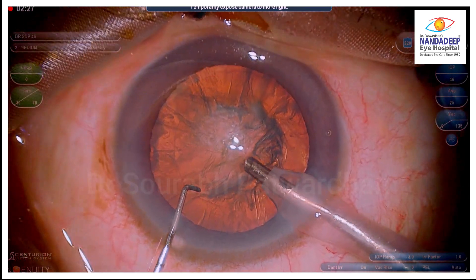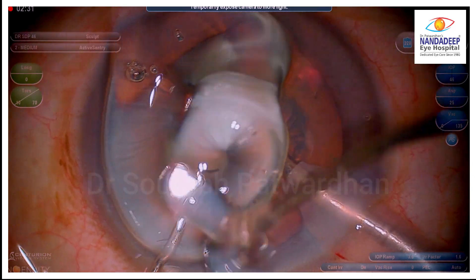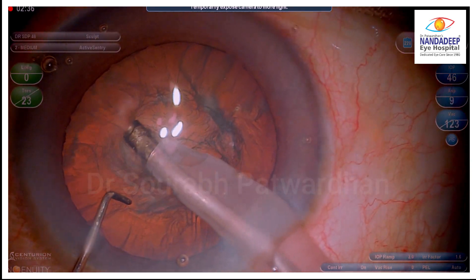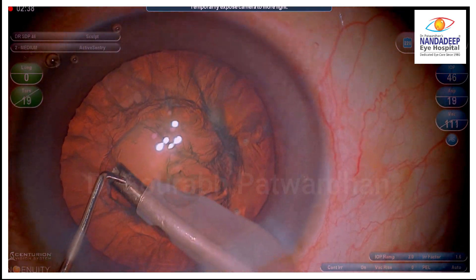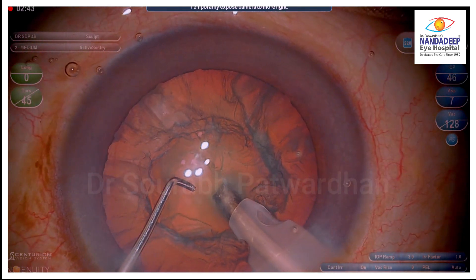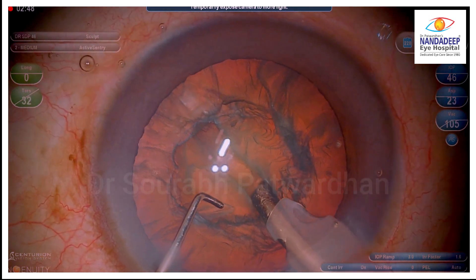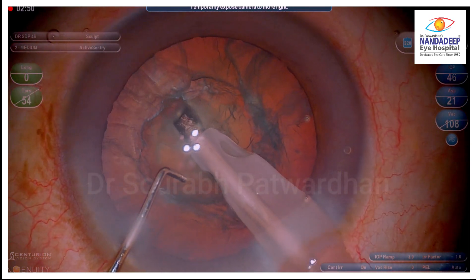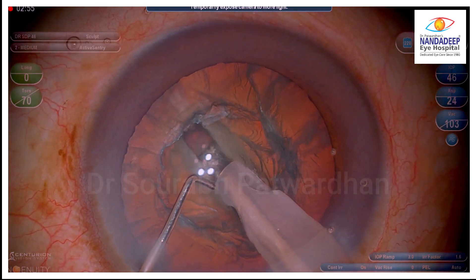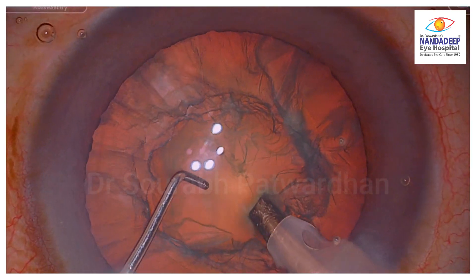This is a grade 2 cataract and I am going to do the sculpting using the Centurion FECO system with torsional at linear power up to 70%. What I want you to observe is that during surgery many times you miss on focusing on some minor things or minor details which are in fact very very important. So let's watch it at higher magnification.